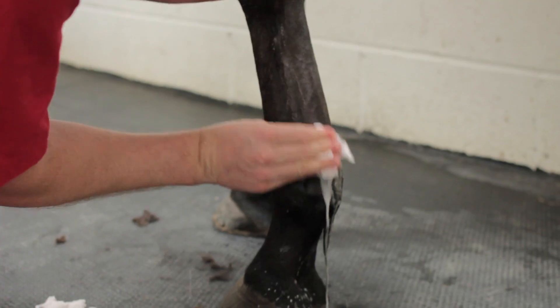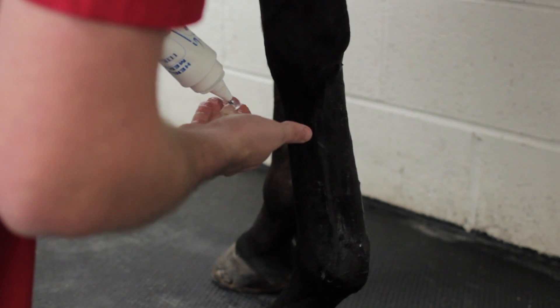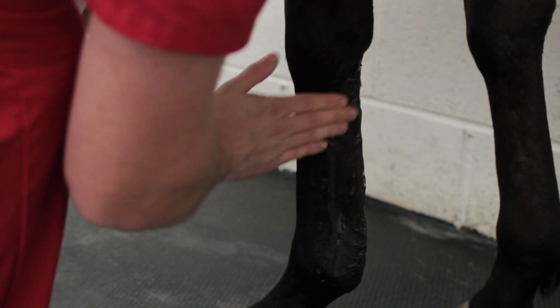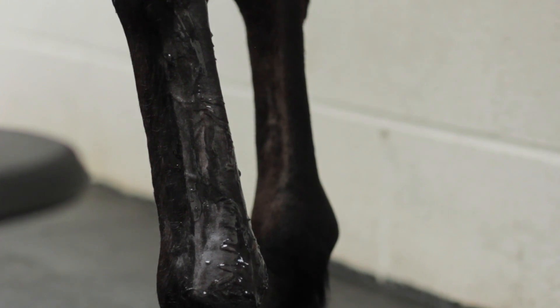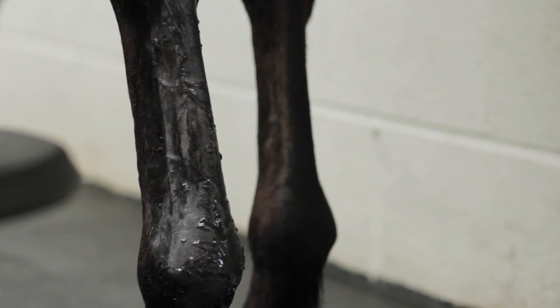Once you've clipped the hair, clean the skin thoroughly — any debris or dirt will interfere with image quality. It doesn't need to be an aseptic clean, but a thorough clean with something like chlorhexidine is needed. Then, on the clean dry leg, apply a good amount of ultrasound gel — don't go overboard, but put a fair amount on and massage it into the skin. Leave that for five to ten minutes; it will soak in and give a much better contact and therefore a much better image than if you just apply the gel and immediately start scanning.